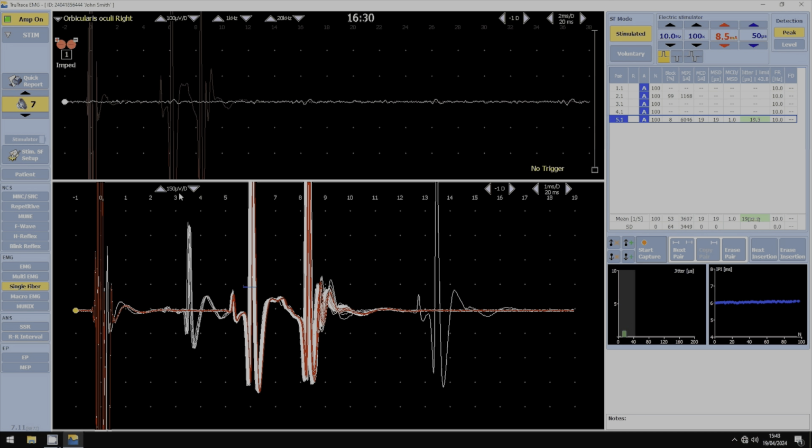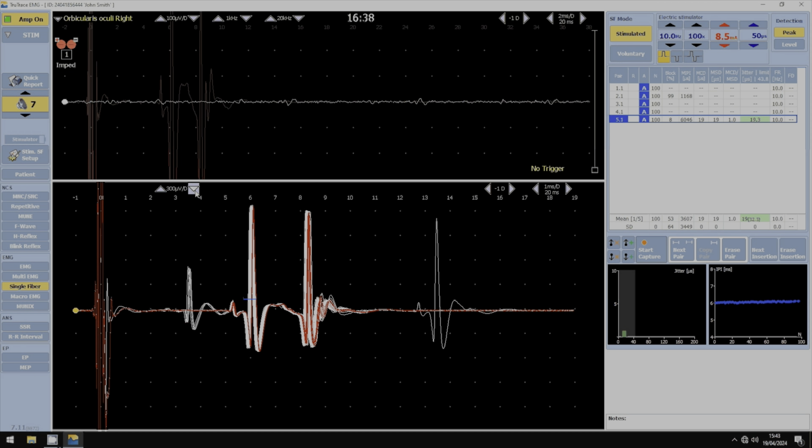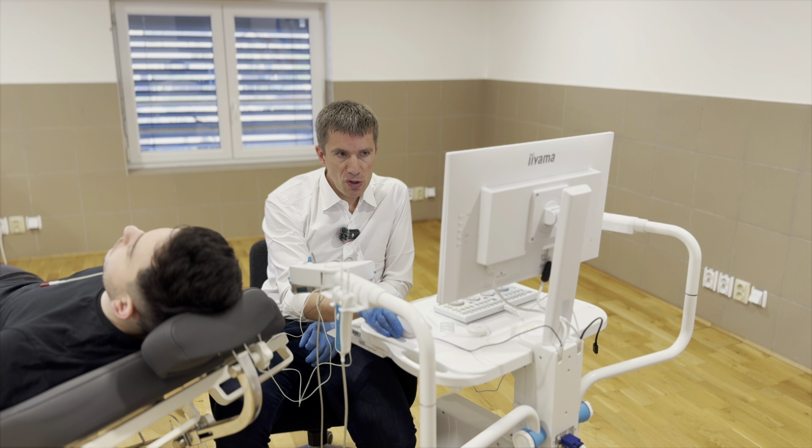The sensitivity is 150 microvolts per division. I can decrease the sensitivity a little bit so that we get the answer completely on the screen. So it's a very high answer. The jitter is 19. Again, the jitter is the average of the consecutive inter-peak interval differences. This calculation is done by the software.